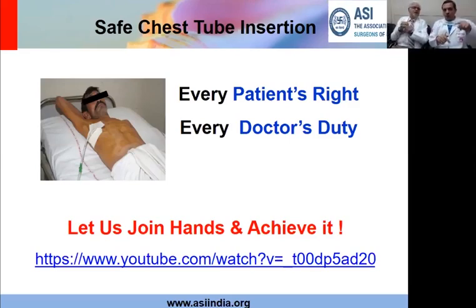So what happens is that the column swing, as we call it, depends on how much difference in pressure is occurring inside the chest with inspiration and expiration. Whenever you have a fully expanded lung, there will be very little change in pressure during inspiration and expiration, and your column swing will be minimal. After a lobectomy, if the remaining lobe does not expand and you still have a lot of space there, that space leads to wide changes in pressure between inspiration and expiration, and that leads to a wide swing. So if you are seeing a wide swing in the column, it means some space is still present inside. But as I said, complete lung expansion clinically and radiologically, no air leak for more than 24 hours, no fresh blood, no altered blood, no pus, and drainage between 100 to 200 cc: that is the time we will remove the chest tube.